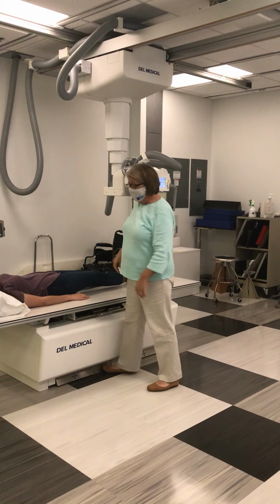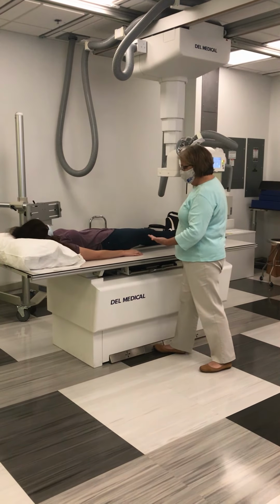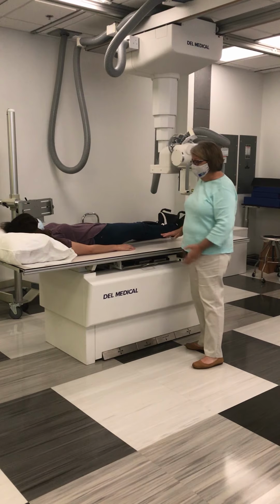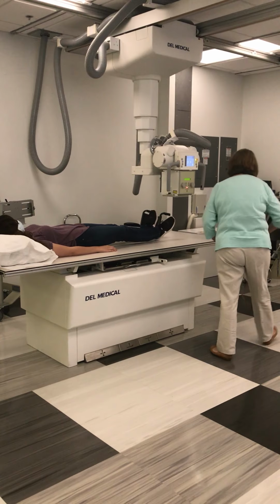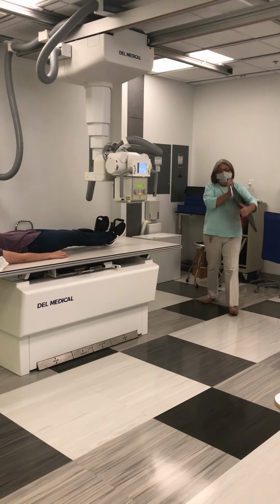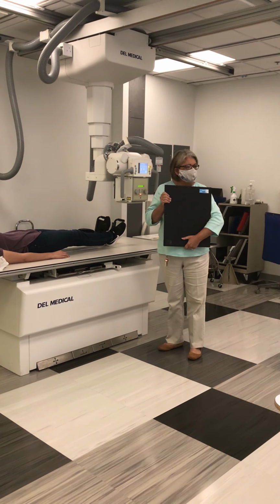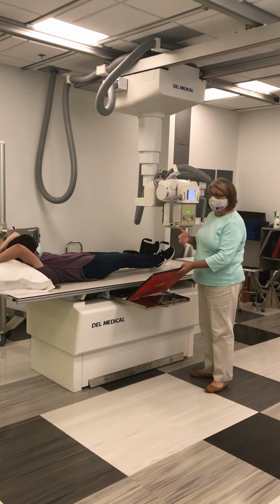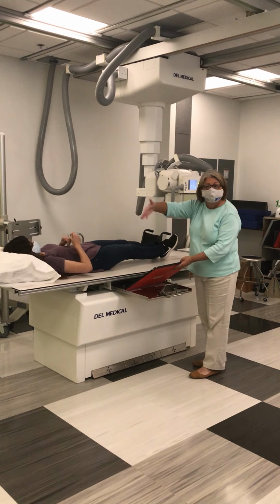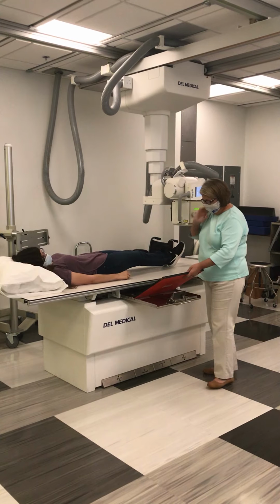Now then, I raise the table for my safety. There's not a predetermined height that you need to raise the table to. Just raise it so that it's comfortable for you to work and so that you're not having to bend down to do what you need to do. Our image receptor for the KUB is going to be 14 by 17, placed lengthwise. And I say lengthwise, that's in relation to our patient: the length of the patient, the length of the image receptor.